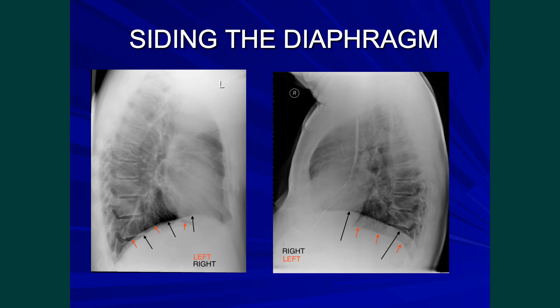The left hemidiaphragm on the other hand goes from back to front but becomes invisible as the heart, which lies just above it, sits on the diaphragm. On the left diagram you can see that the right hemidiaphragm is clearly seen from back to front and goes across the cardiac silhouette.